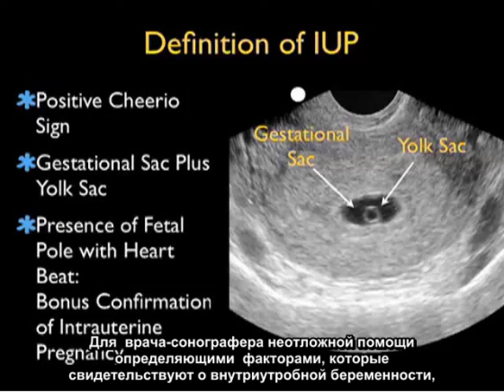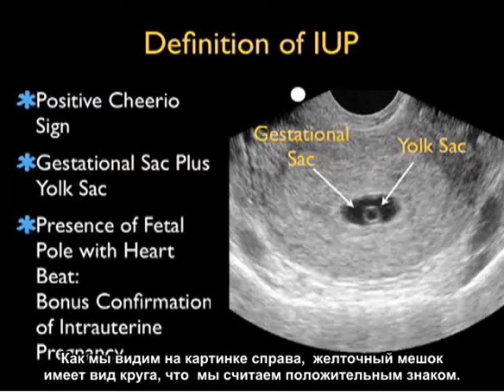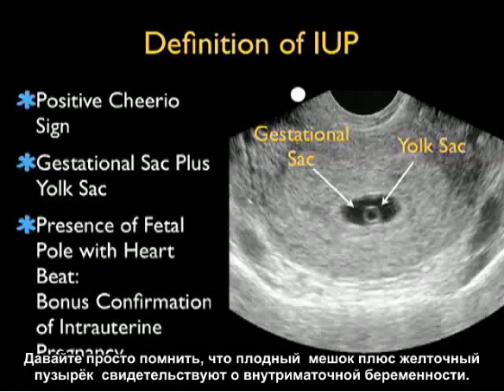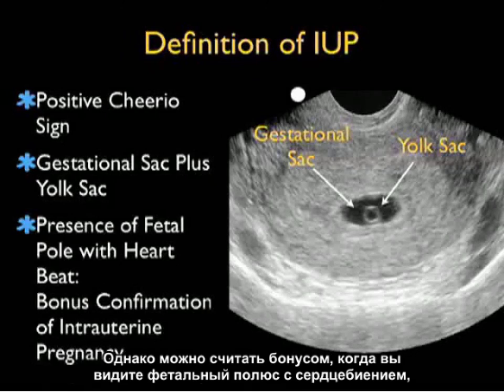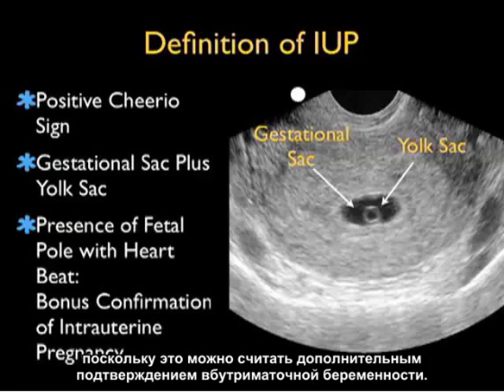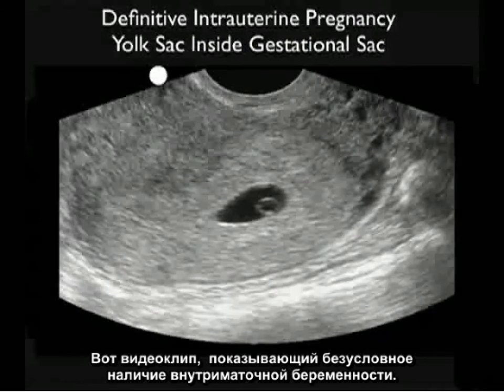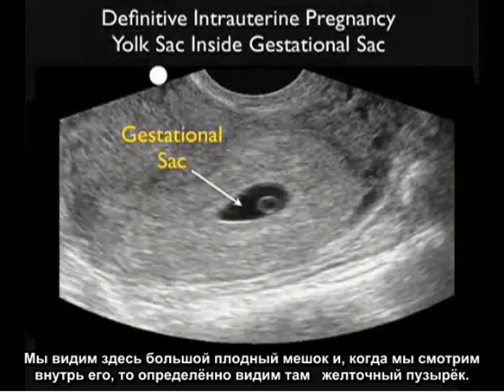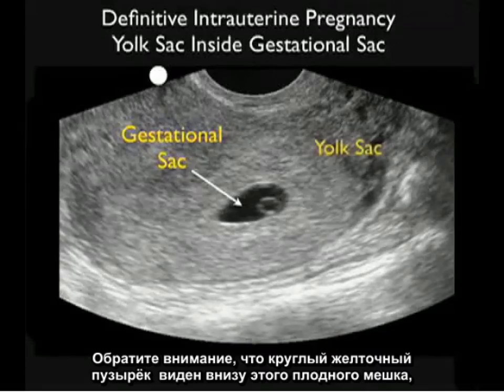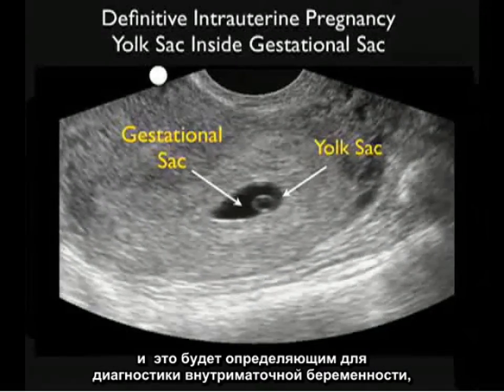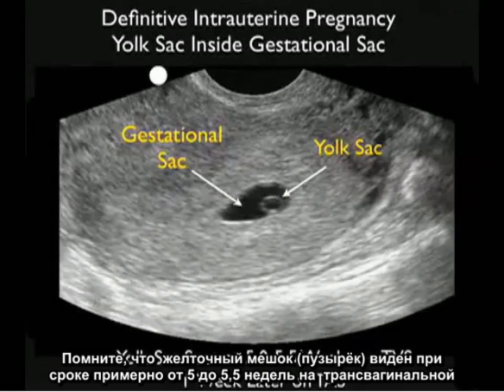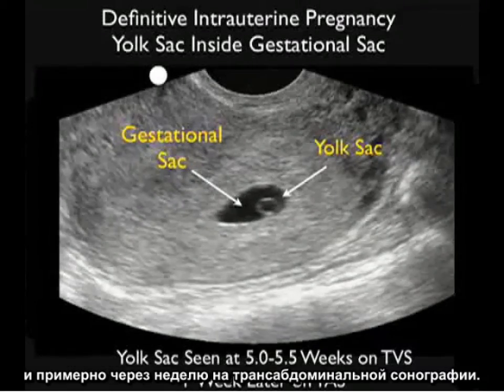The findings we define as indicative of an intrauterine pregnancy for an emergency physician sonographer are the presence of a gestational sac with a yolk sac inside. The yolk sac has a circular appearance we call the positive cheerio sign. Gestational sac plus yolk sac is indicative of intrauterine pregnancy, though bonus points are given if you see a fetal pole with a heartbeat. This video clip shows a definitive intrauterine pregnancy with a larger gestational sac and the positive yolk sac or cheerio sign visible towards the inferior aspect, effectively ruling out ectopic pregnancy in the vast majority of patients. The yolk sac is seen at about 5 to 5.5 weeks on transvaginal sonography and about a week later on transabdominal sonography.